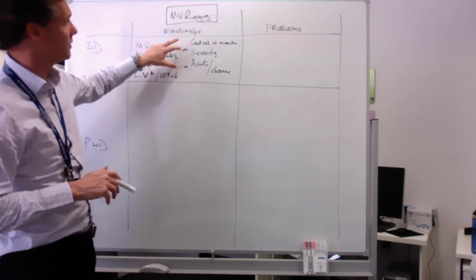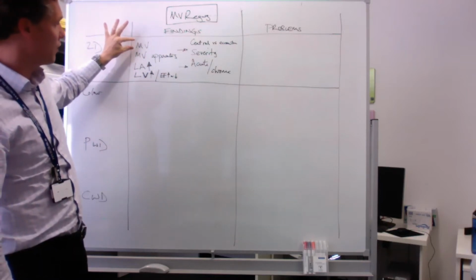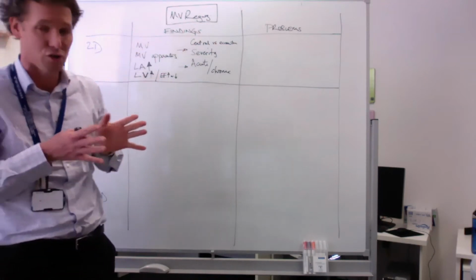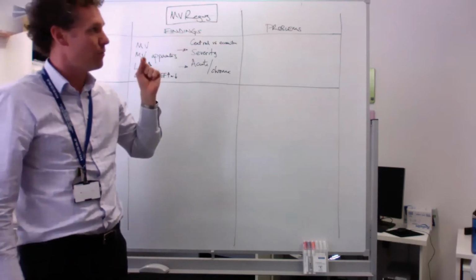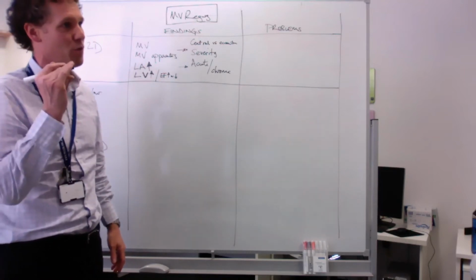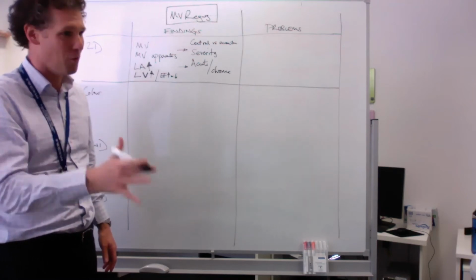I guess what I'm trying to say is it's just MR that we're trying to assess. As mitral valve regurgitation gets more severe, your ejection fraction will go up to begin with as a compensatory mechanism, because you've got two holes coming out of the left ventricle. So a normal ejection fraction in someone who's got significant MR is not a normal finding.